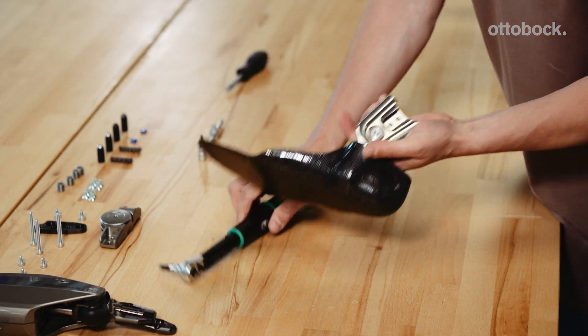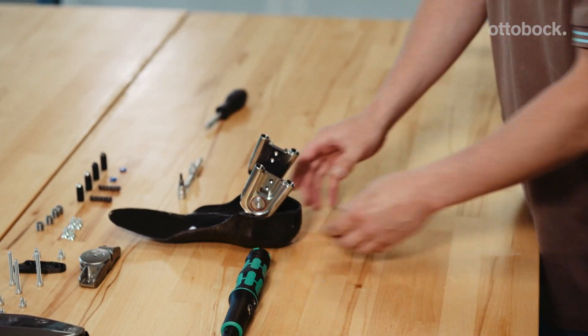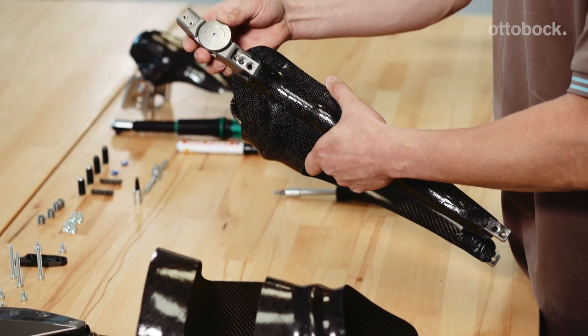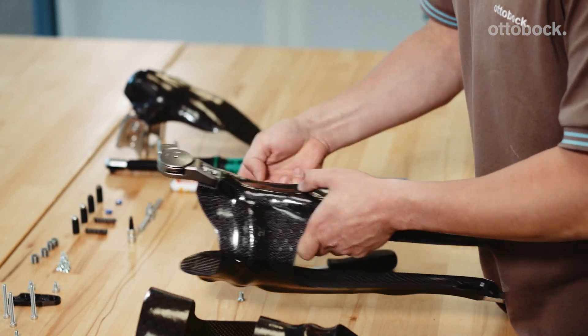Mount the ankle joints on the foot stirrups. Mount the medial support on the medial lamination bars using the supplied screws.